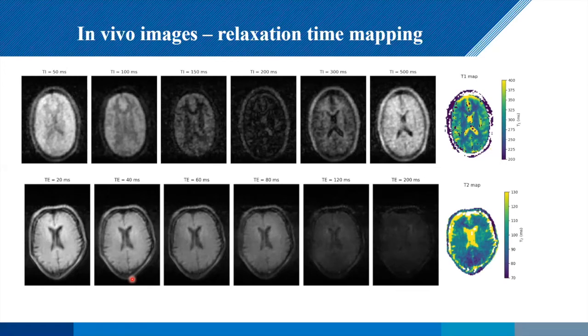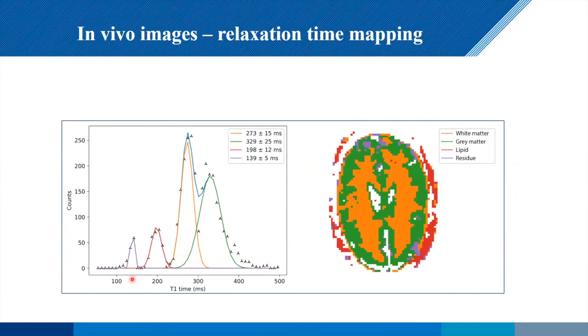But T1, T2 maps can come out, and then these can be quantified in terms of white matter, gray matter, and then the lipid. And you can see this forms quite a nice basis for doing an image segmentation. And again, there is nothing else going on here. This is no AI, this is no extra information. That, of course, is a completely valid approach. But at the moment, we're simply doing this off raw k-space data.